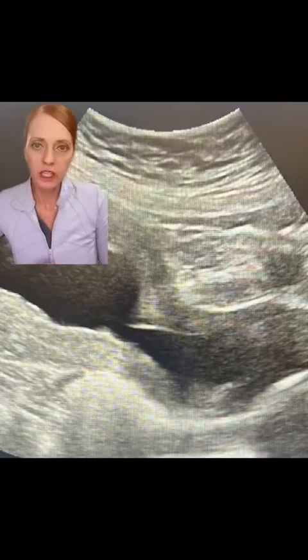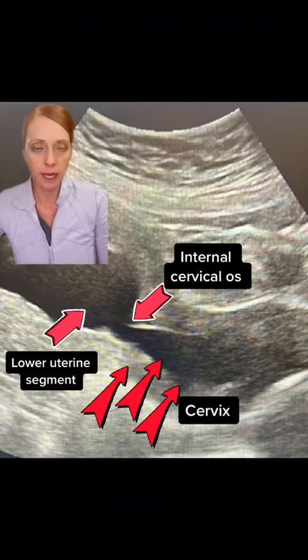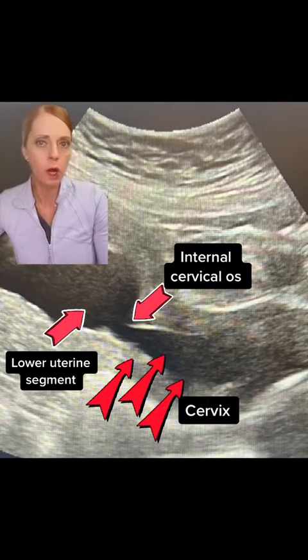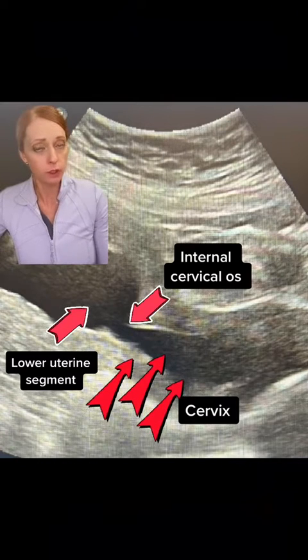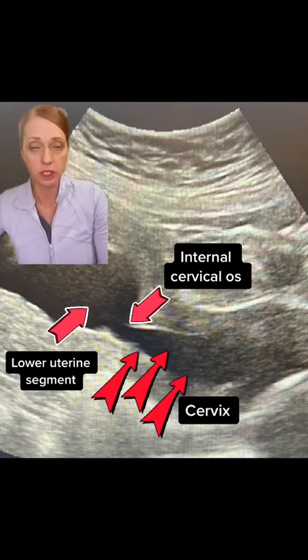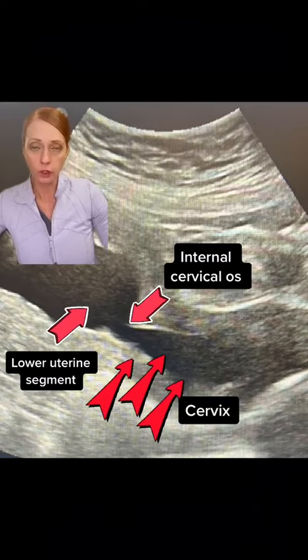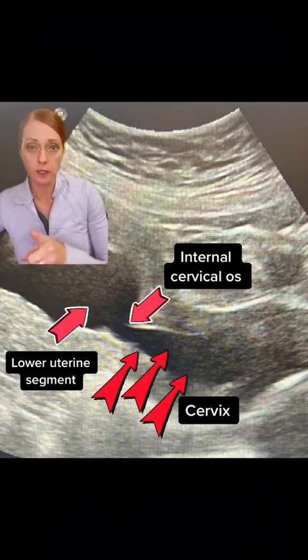A patient came in for a routine anatomy scan — no symptoms, no complications, nothing. And the first thing we do, because we do universal cervical length screening when these patients come in for their anatomy scans, was do a transabdominal view of the cervix. And this is what we saw.